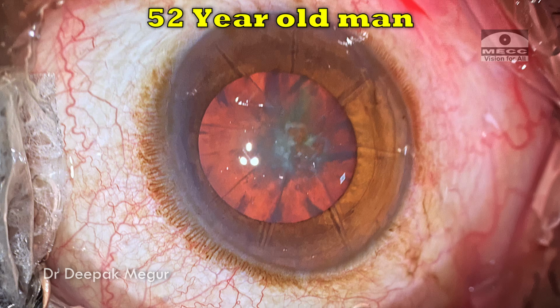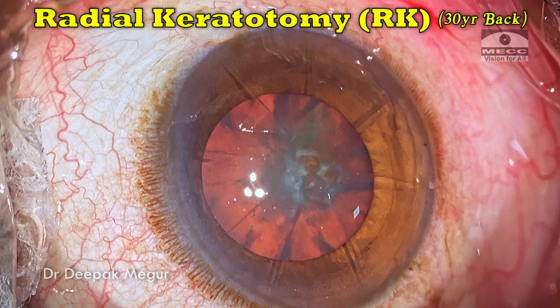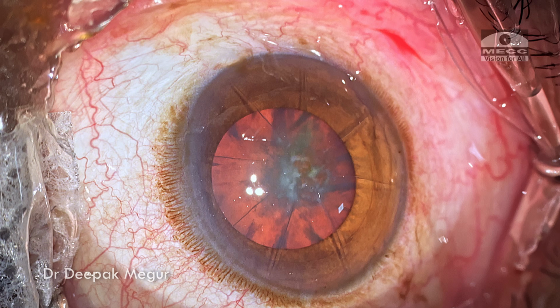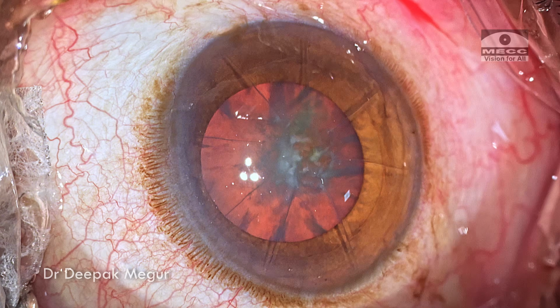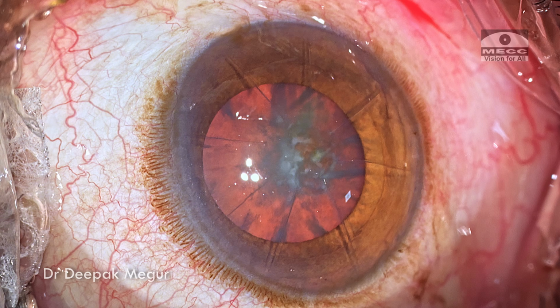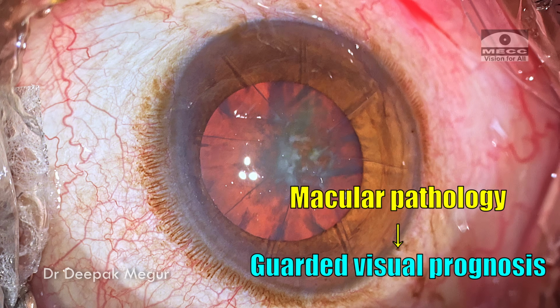Hi, he is a 52-year-old gentleman who has undergone radial keratotomy about 30 years back, and now he's come for cataract surgery of this eye. He's got pathological myopia in both the eyes, and this eye is the worse eye. He also happens to have a macular pathology, so the visual prognosis is of course a little guarded in this patient.